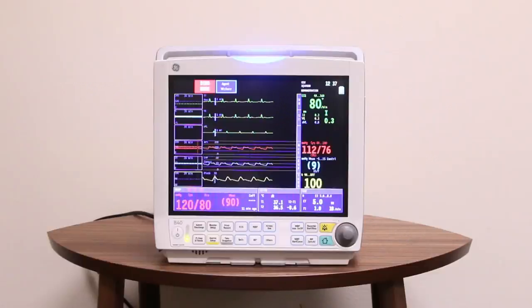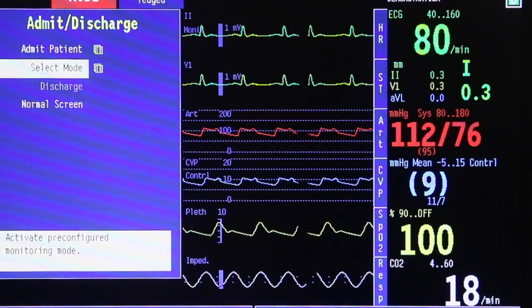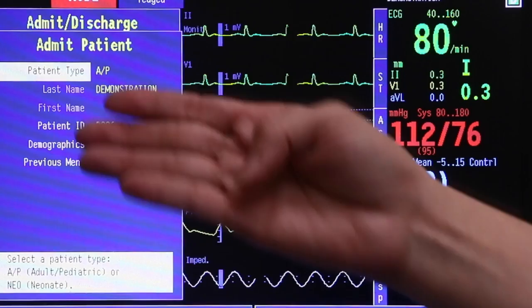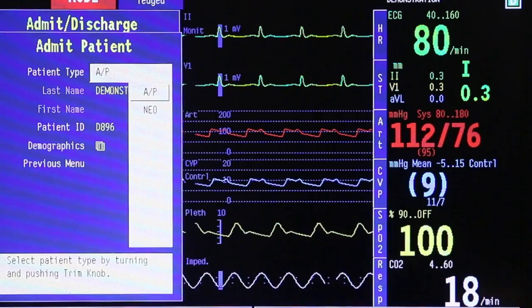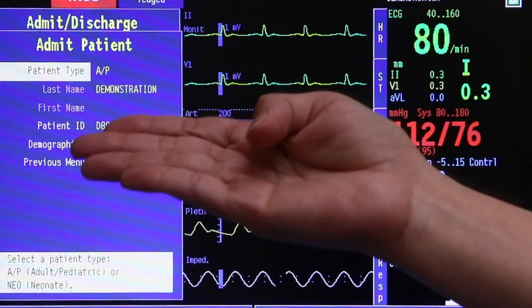To access the Admit Discharge menu, press the Admit Discharge command key. The menu title will appear on top. Use the trim knob — rotate left or right, then press to select the option. To admit a patient, first choose the patient type. AP stands for adult or pediatric. Press once to choose AP or neonate. Press the trim knob once to confirm your selection.